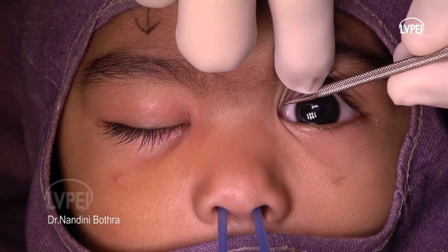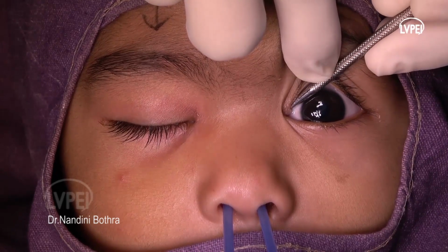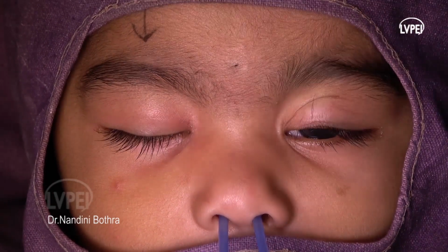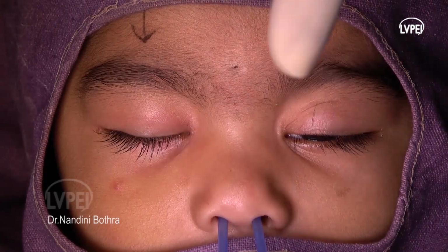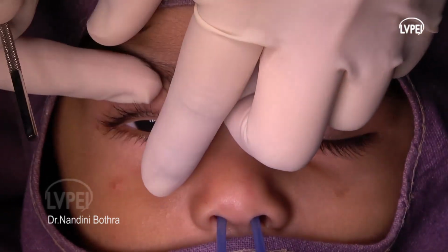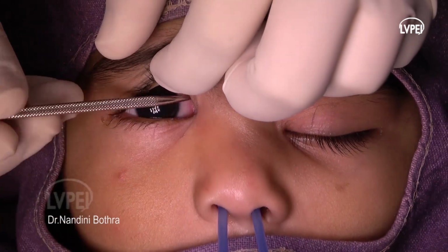The upper punctum is dilated using the short taper Nettleship punctum dilator. The dilator is inserted perpendicular to the punctal opening and then is turned to align parallel to the lid margin to enter the horizontal canaliculus. This procedure is then repeated on the affected side.